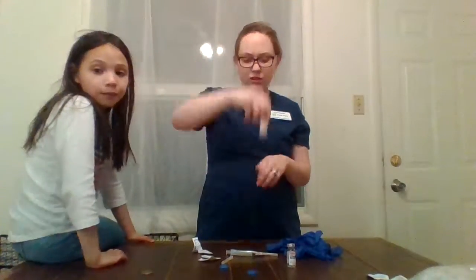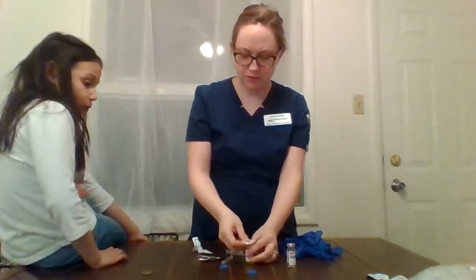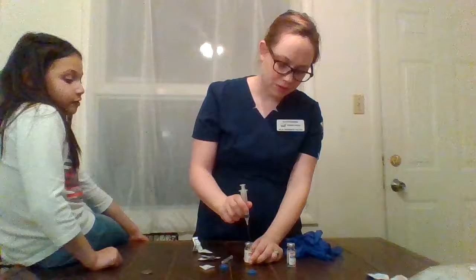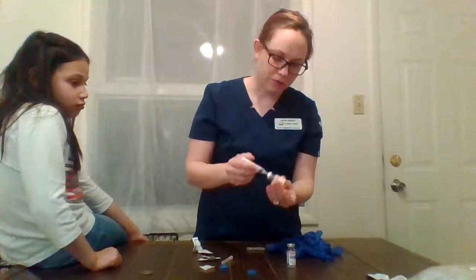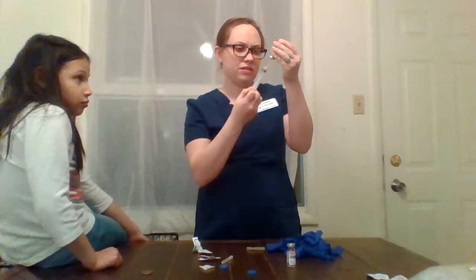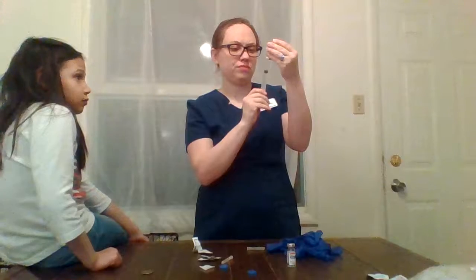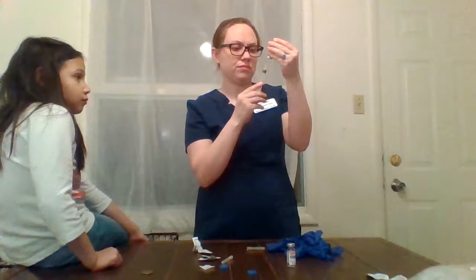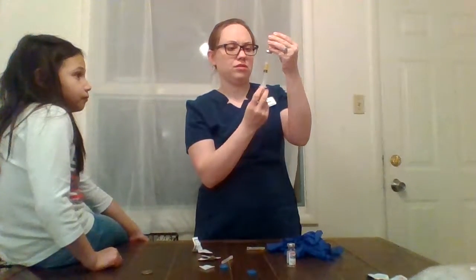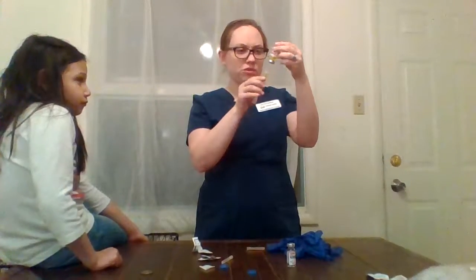Once that's dissolved, I'm going to clean the top again. Now I'm going to draw up the amount of medicine that I need, making sure there's no air bubbles.